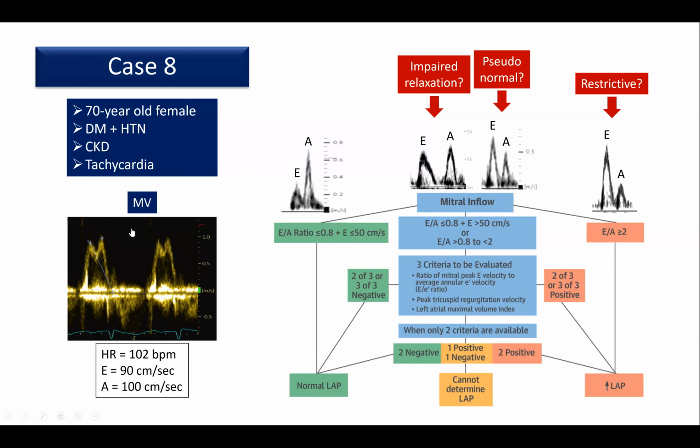So where does this put us? I mean, does this patient have impaired relaxation? Are we in this pseudo-normal pattern? Are we here in the restrictive pattern?